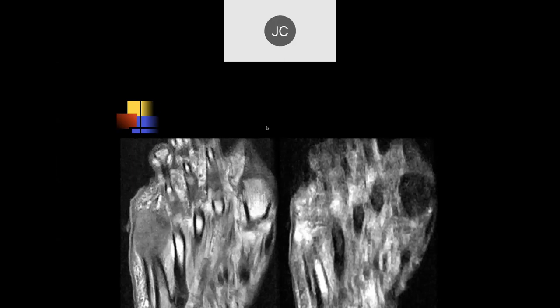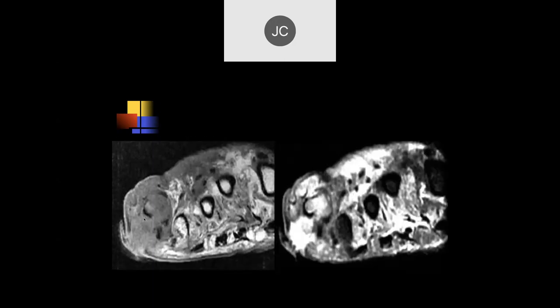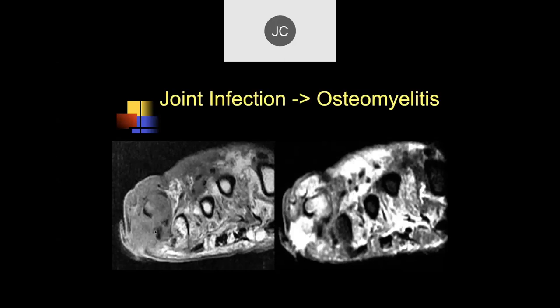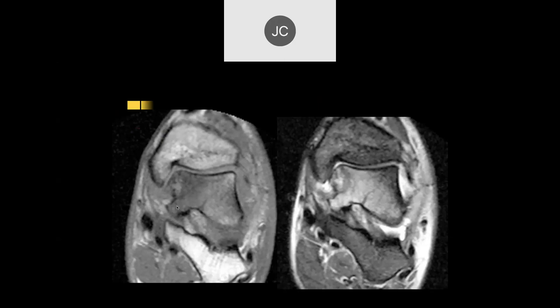There's a lot of soft tissue that looks like it's eroding away at the fifth distal metatarsal. On the coronal images, there's a lot of bony destruction, soft tissue thickening, and fluid. This was an infection of the fifth metatarsophalangeal joint — a big abscess with osteomyelitis.